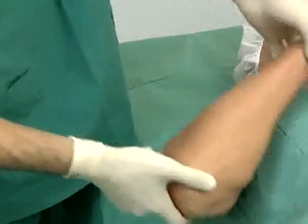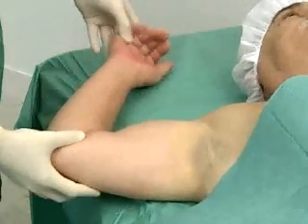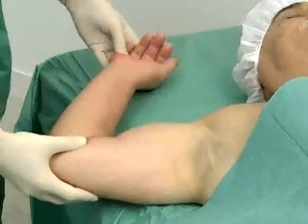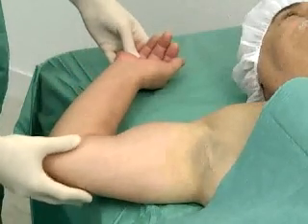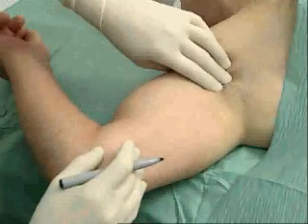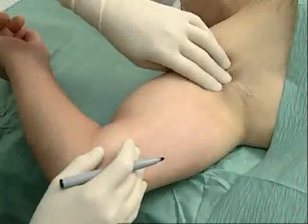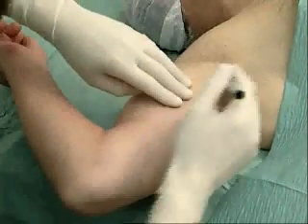The patient is in supine position with the arm abducted to 90 degrees at the shoulder, the elbow flexed to 90 degrees, the forearm externally rotated, with the hand dorsum lying on the table.